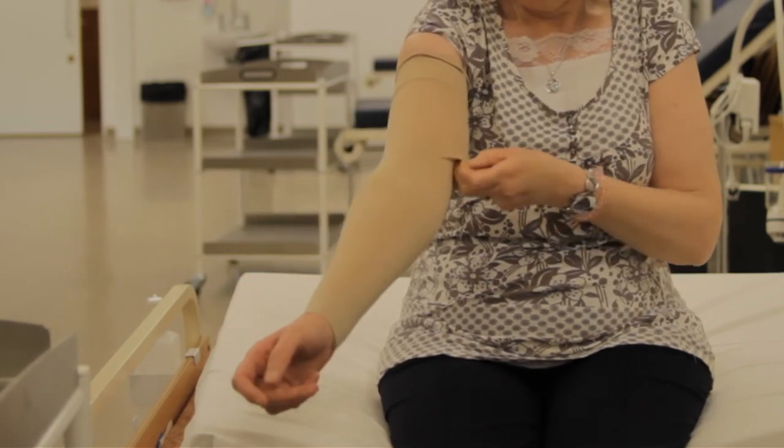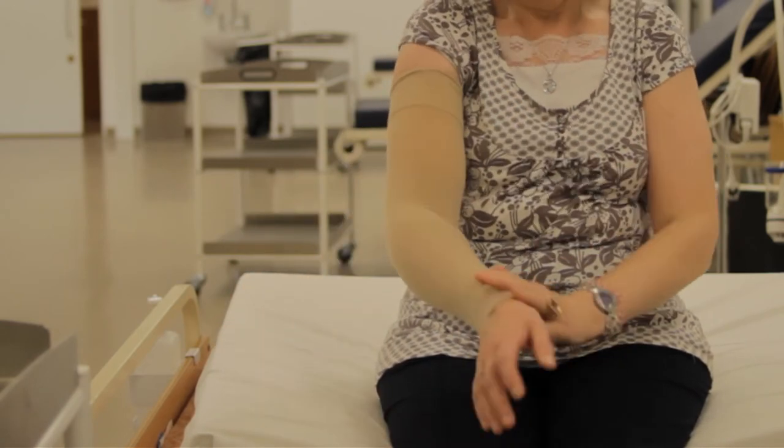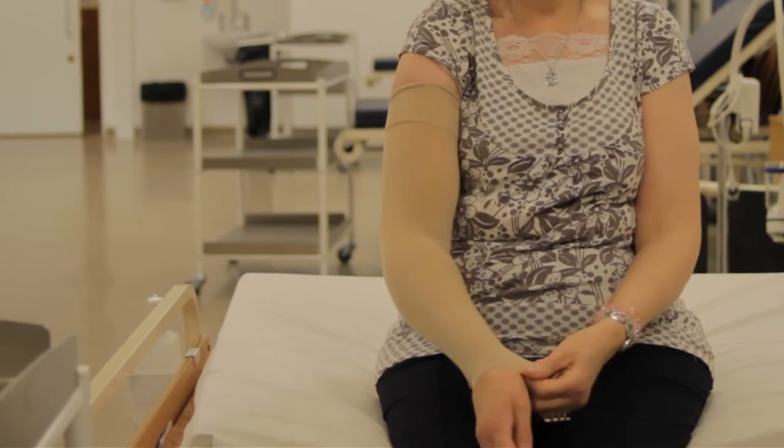Continue until the garment is smoothly placed on the limb. Make sure there are no wrinkles or any creases anywhere in it at all. To take the garment off, do exactly the same thing but in reverse — start at the top of the garment and roll it carefully down until you get to either the hand or the foot at the bottom.